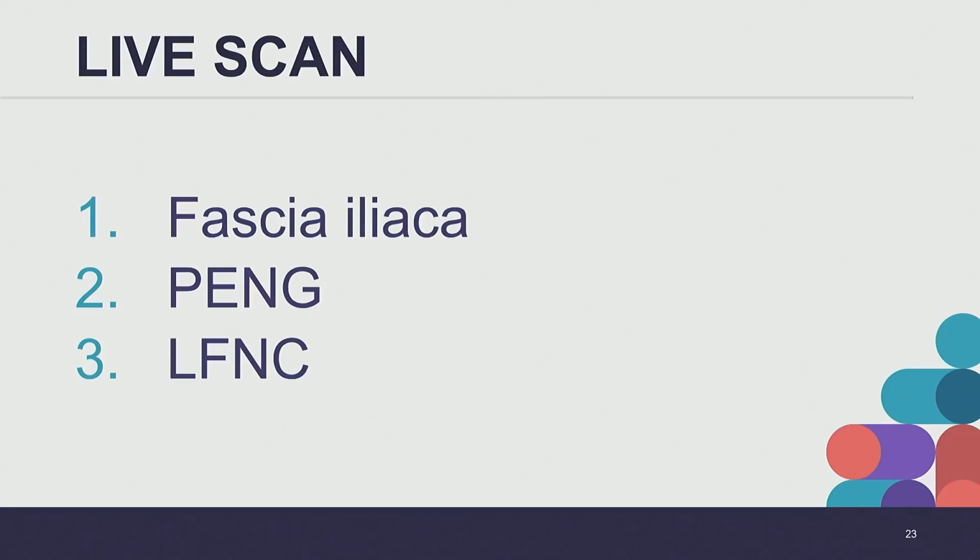There's my sartorius starting to come into view. That's the fat pad right there. The sartorius terminates right around there. Here's tensor fascia lata. And then there's a little fat pad right there. And you can see that little berry. You can see how superficial this is. This is about half a centimeter.